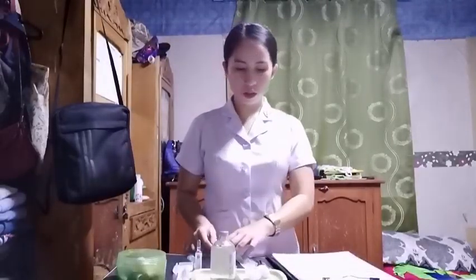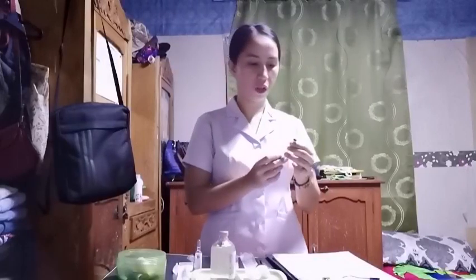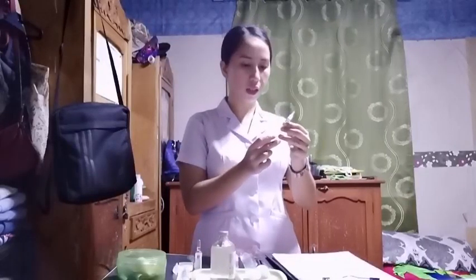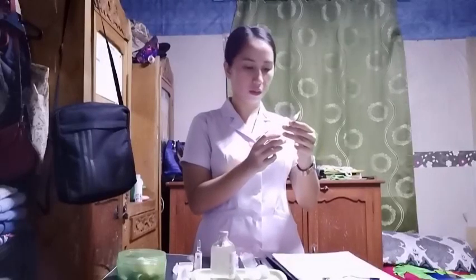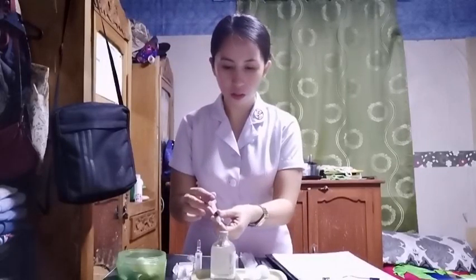Now take the syringe and uncap it. And then draw air into the syringe. The air to be drawn inside would be equal to the amount of the medication needed prescribed by the doctor. Now inject the air into the vial. Invert the vial and draw the exact medication needed.